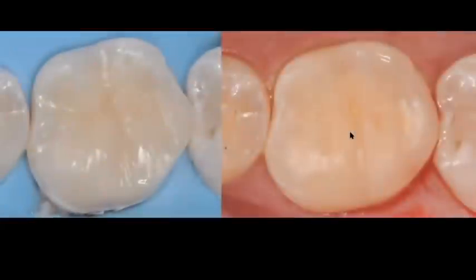And what we do there, again, one horizontal layer, 1 to 2 millimeters thick, and then we start building each cusp individually. So if you look at this here, this is immediately after I have completed just building the composite using an Explorer and using a core packer. So I'm just going in, creating with my Explorer the central fossa, the buccal and lingual grooves, my mesial marginal ridges, everything, all the details that I want to recreate. I try to do the best I can using my Explorer.